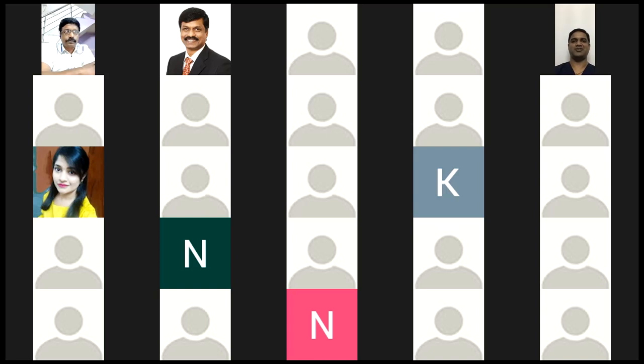I have done more than 250, 300 blocks, sir. I haven't come across any pneumothorax, because it's very superficial and you should not go much beyond. The needle tip should always be visualized. If you don't visualize the needle tip and go deeper, more than 4 centimeters, you can have a chance of pleural puncture and pneumothorax. More than 4 centimeters, you should not go. Ideally, the cords will be located within around 3 centimeters, and you can visualize the needle with the ultrasound.